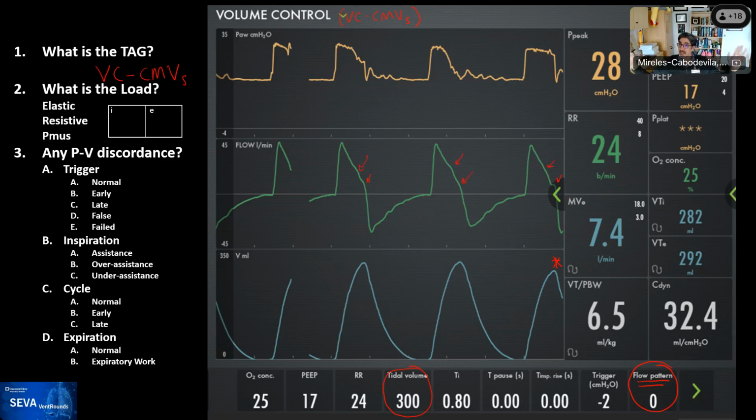And that happens, right, Rob? There are ventilators that tell you that they're controlling the flow, but in reality, they are just manipulating pressure to give you a waveform to look like that. Am I correct or not, Rob?